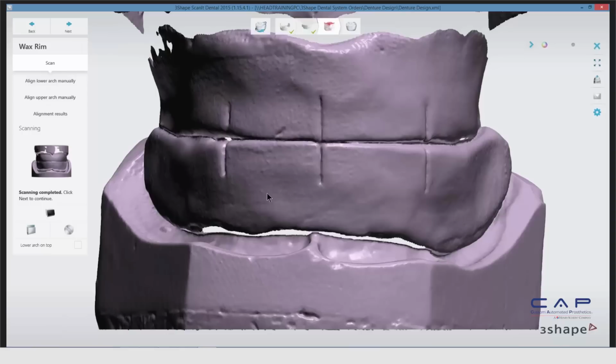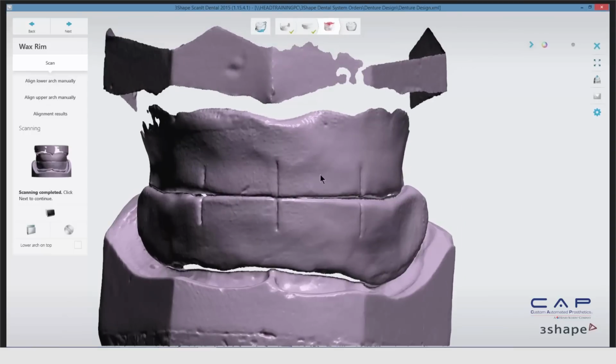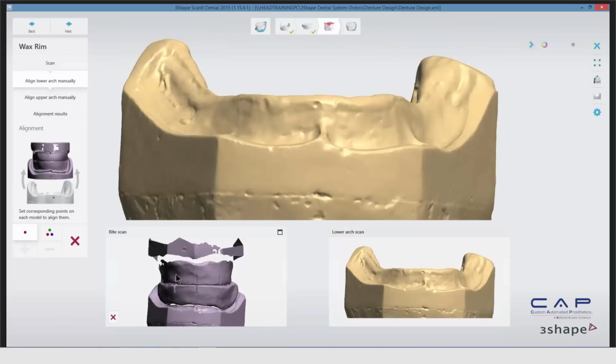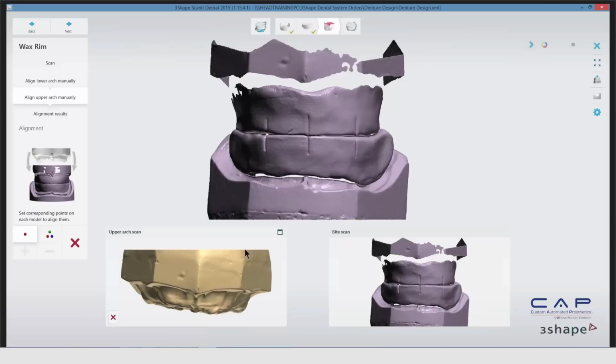Okay. So now you can see that the wax rim has stopped scanning and we've got post-process here. And this is just a typical wax rim that we had just made up for this case, but you can see that we had our midline kind of marked out and we have our canine points marked out as well. So what we're going to do now is we're just going to go ahead and align the two scans that we did prior to this to these instances. And this is why I don't trim off those scans, because we need as much as possible to align it to. So lower is pretty good because we can pick some individual landmarks that we can go ahead and align to, and it's very easy to align to. But the upper, since it's on the top portion of that, it's reaching the limitations of the scanner that we have here.